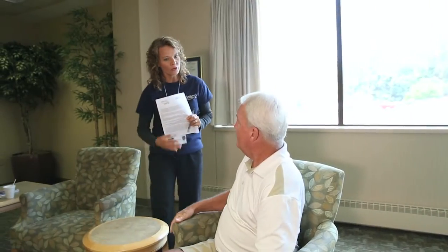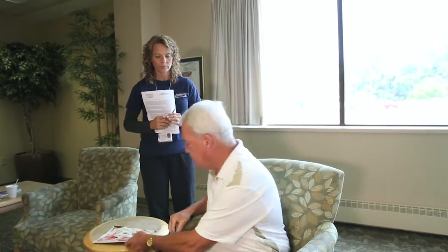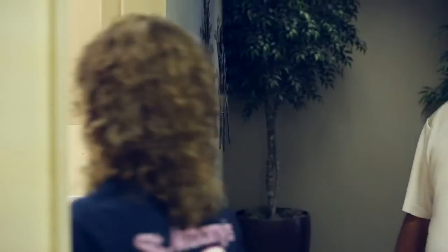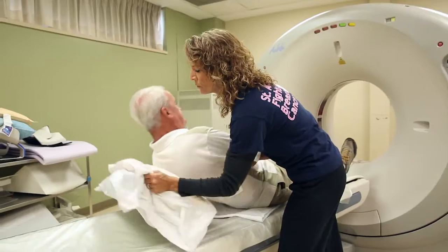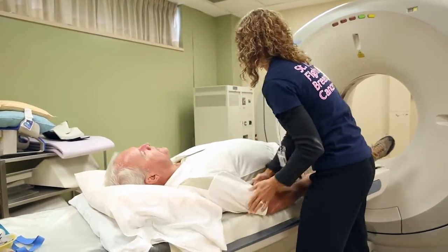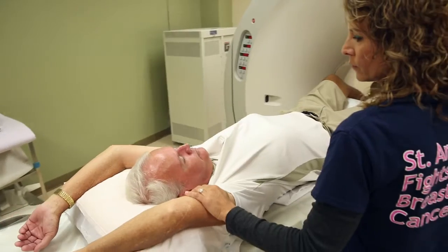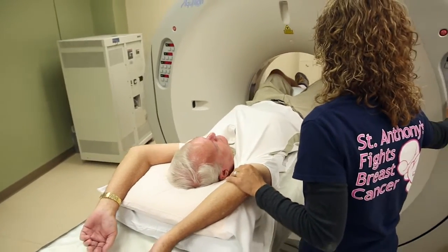Come on with me, we're gonna go into the room for your test today. The technician comes and gets you, takes you into where the CAT scanner is. They'll help you get on the table. They'll slide you into the CAT scanner. They'll ask you maybe to hold your breath for 10 seconds and put your arms up over your head.